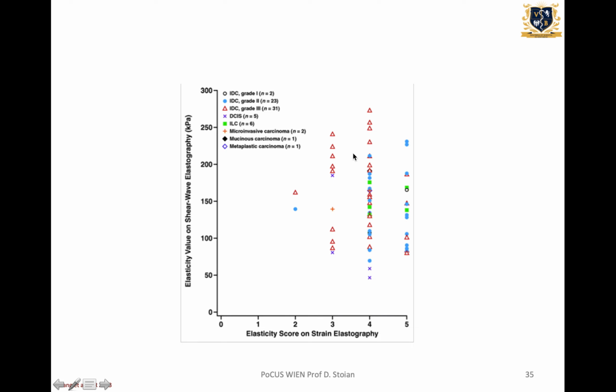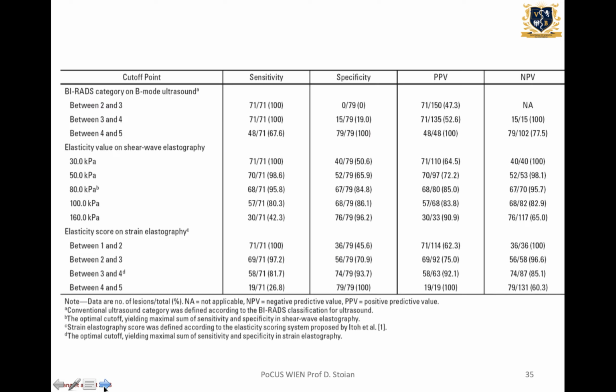And actually, the vast majority of cancers are stiff on elasticity, but there are some intraductal carcinomas, mucinous carcinomas and tubular carcinomas which can appear soft on elasto.